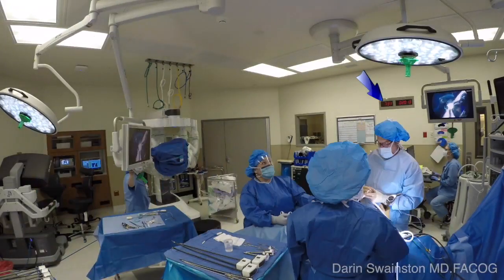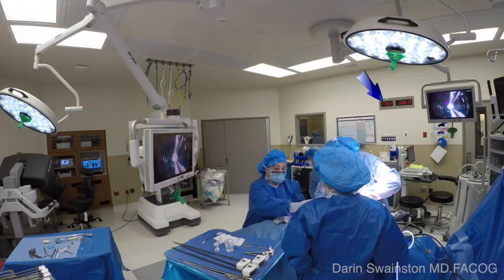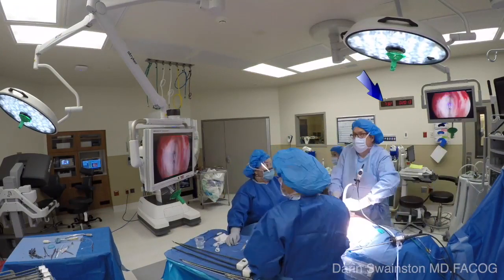This video was prepared to show time-lapse photography of just how easy it is to position the patient and dock the XI robotic platform.